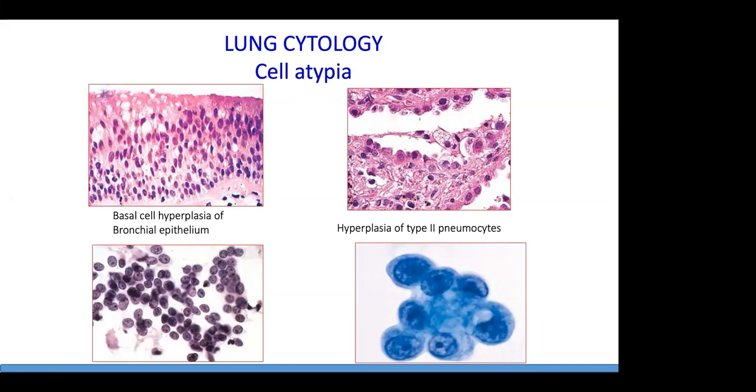So one tip here is that in a patient with diffuse lung lesions, be very careful to call these carcinoma.